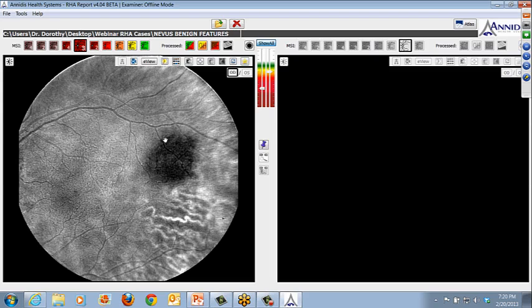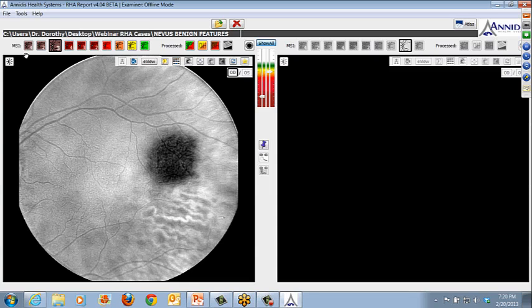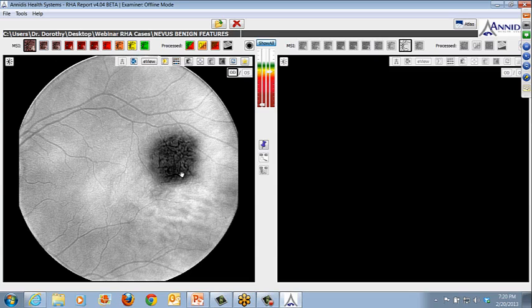You will notice with multispectral imaging, some of these borders don't look as perfectly smooth as they would on a traditional view or on traditional fundus photography with a variety of filters. So that's not too unusual. I'm going to show you. But again, highly regular lesion. The pigment is regular. It's not 100% smooth, but it's regular. Okay. And it will start to fade as you get down into the choroid.